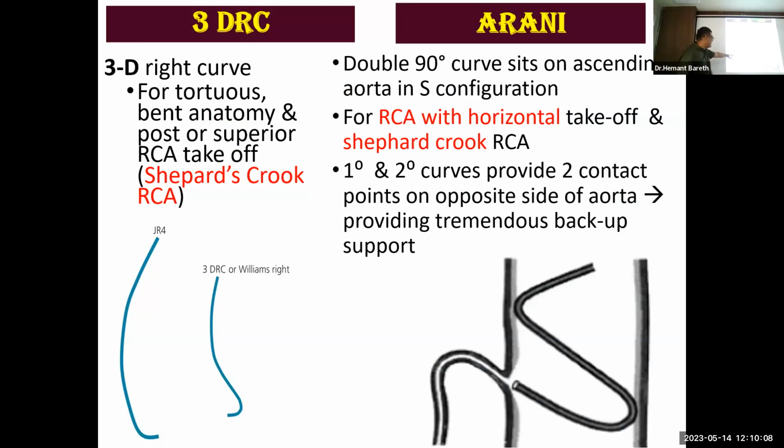Then this is the catheter I wanted to tell you about. This is the 3DRC catheter. And this is the best catheter for a shepherd's crook RCA.